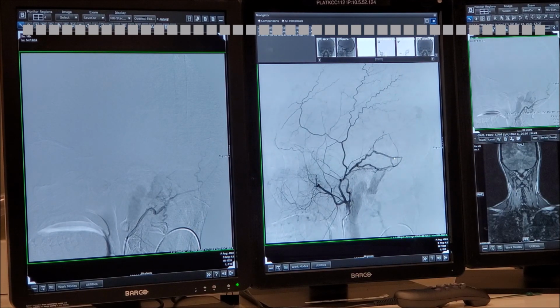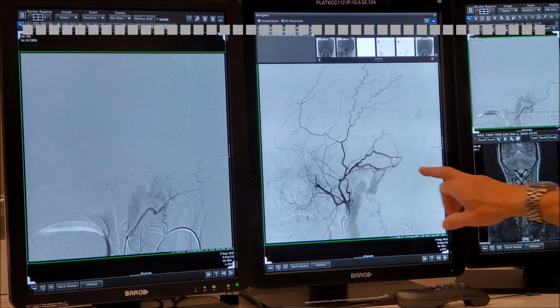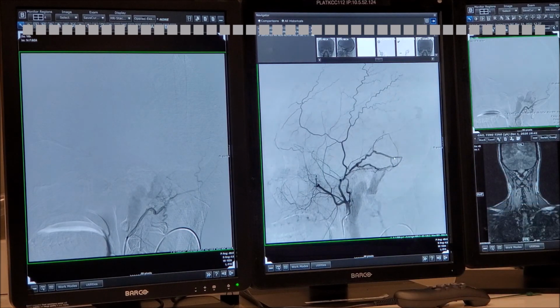So as we were talking, which would be the best catheter to treat a dural fistula? From all the catheters that we have. I think it's big enough for a Headway. Headway, I would not use a Headway. Yes, you can use a Headway. What was the best catheter you've ever seen to inject Onyx or Phil or whatever? What's the best catheter we have?